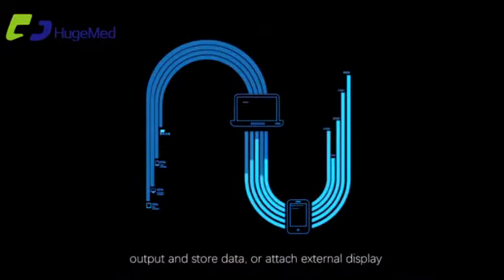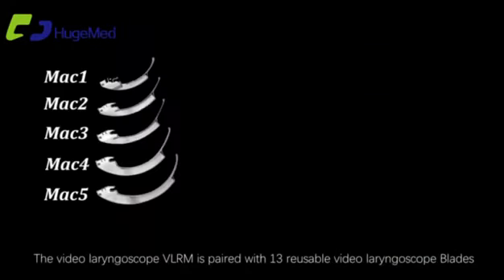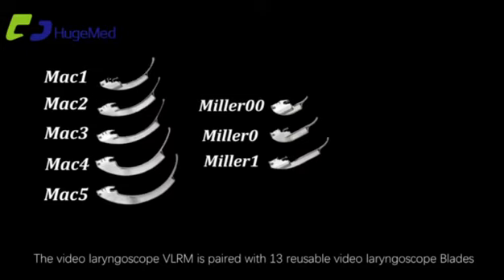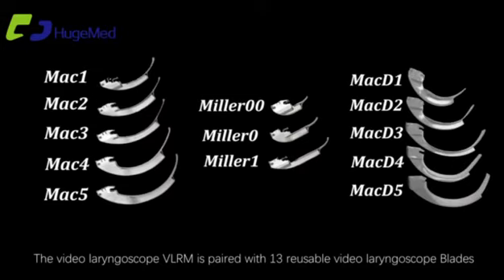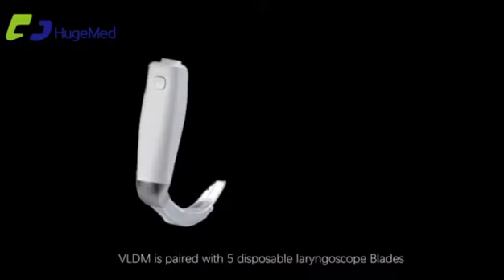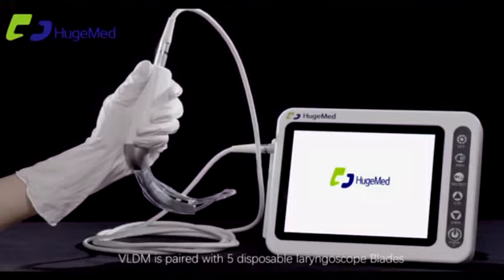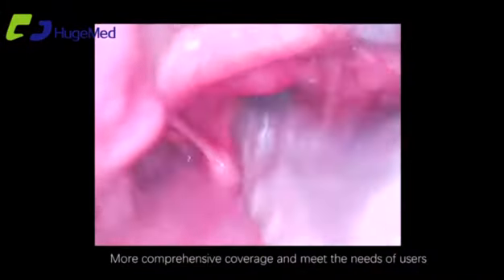Video output and data storage, or attach an external display, to meet the needs of more application scenarios. The video laryngoscope VLRM is paired with 13 reusable video laryngoscope blades. VLDM is paired with five disposable laryngoscope blades for more comprehensive coverage.